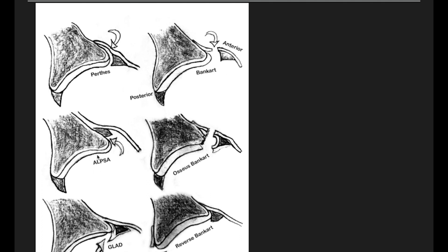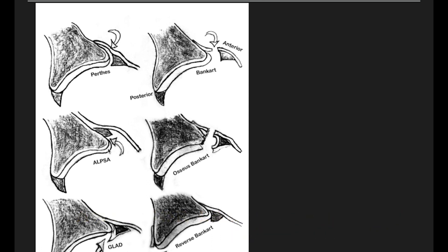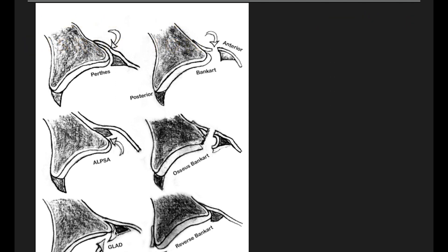Coming to the ALPSA: ALPSA is anterior labral periosteal sleeve avulsion, where you can see the medially displaced inferior glenoid labrum in between the periosteum and the bone. GLAD is glenolabral articular disruption, where you can see the tear of the anterior inferior glenoid labrum along with the cartilage. Here the cartilage is intact in Bankart, but in GLAD the cartilage is also torn out.